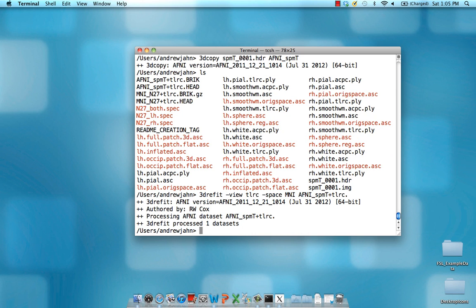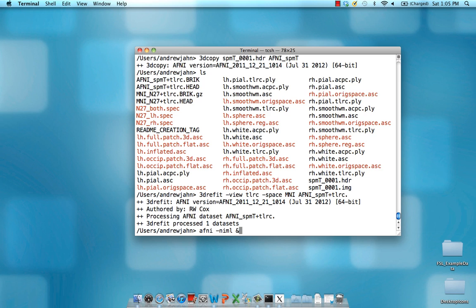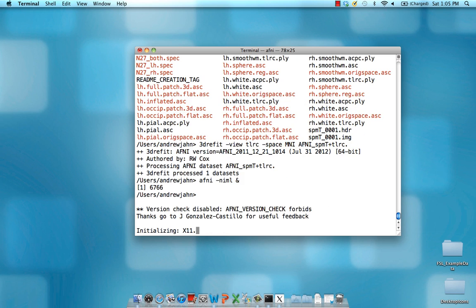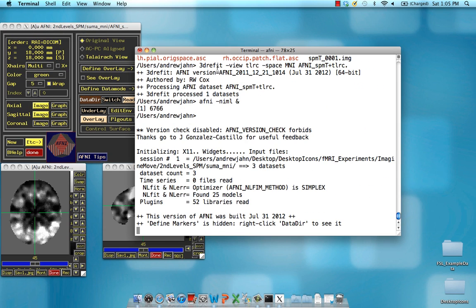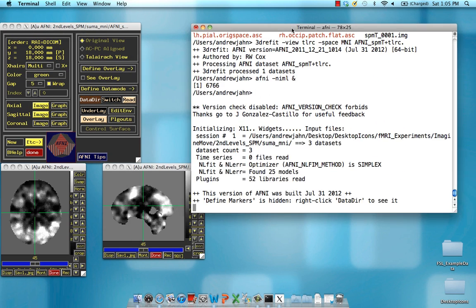Now that that's all been done, we can go ahead and open up AFNI using the -NIML option. This will allow you to listen for Neural Imaging Markup Language, which is how AFNI communicates to SUMA. I'll also add an ampersand so I can use this same terminal later.